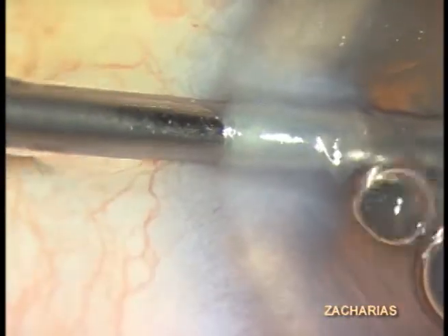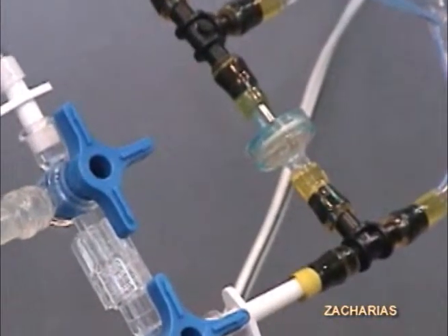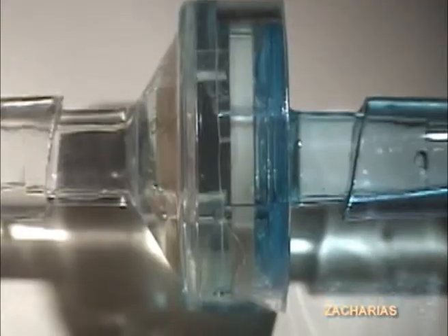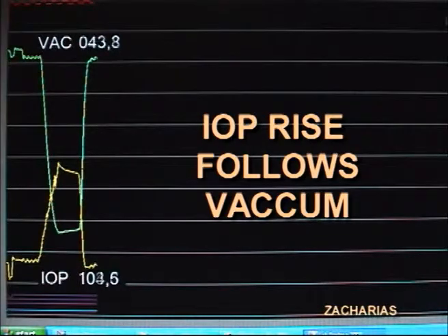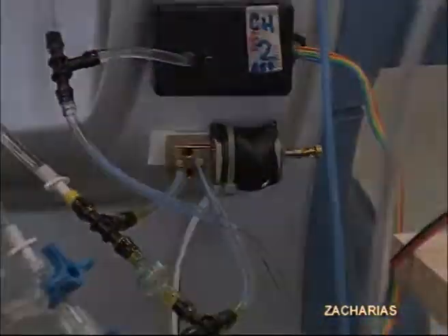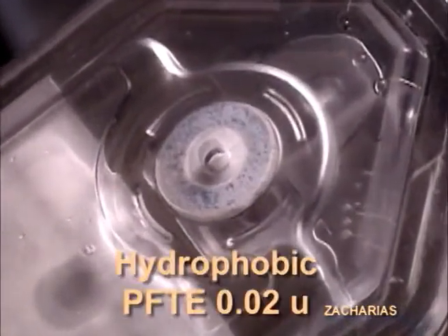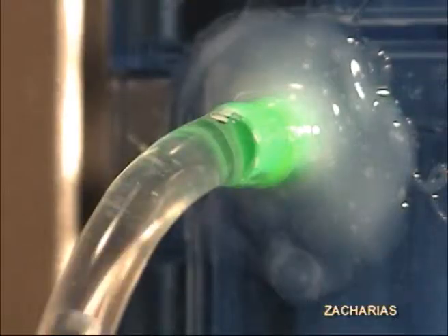Considering that no surgery can be made absolutely leak-proof, a compensating mechanism was introduced by using a console-controlled valve to refill the lost volume while in foot pedal position 1, and also periodically during extended operation in positions 2 and 3. Surprisingly, intraocular pressure showed an increase proportional to the vacuum levels in the aspiration line during occlusion. The introduction of a venting pinch valve in the irrigation line allowed to cancel this undesirable behavior. A special hydrophobic air extracting filter was included to remove all unwanted bubbles in the fluidics system to help maintain a predictable performance during operation.